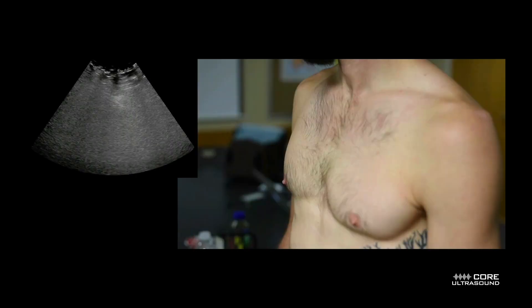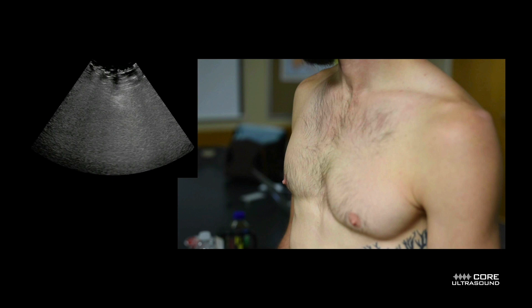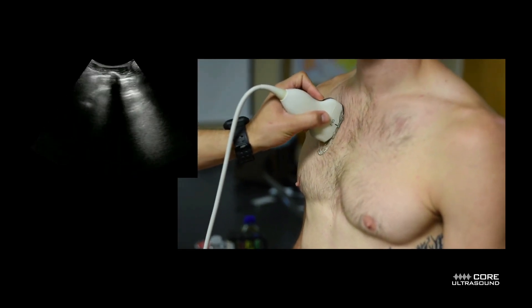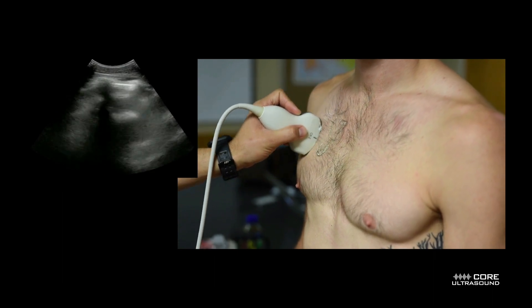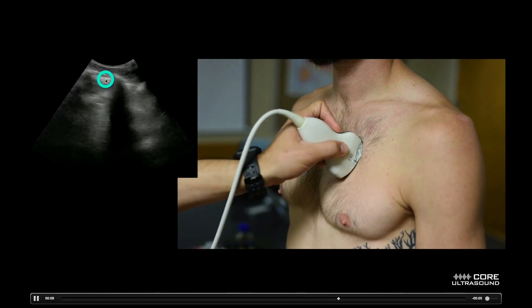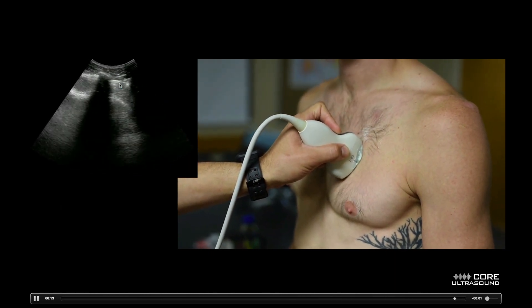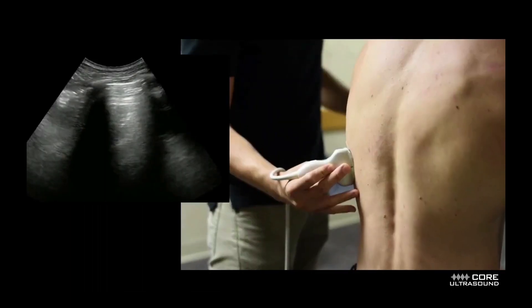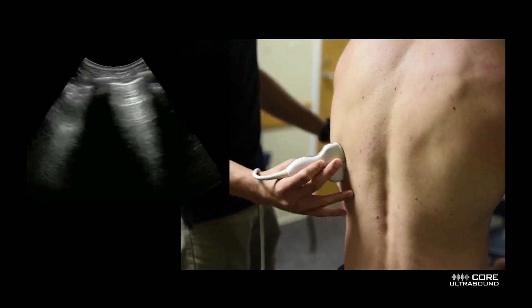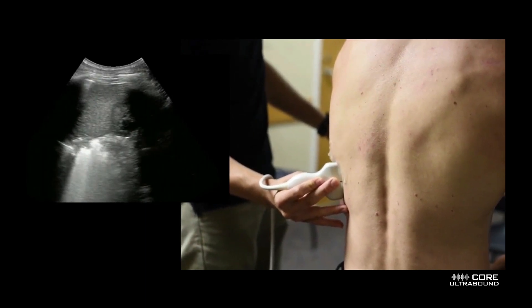When scanning the patient, I'll place the probe with the probe marker facing up and then lawnmower back and forth along the entire anterior, lateral, and posterior thoracic wall. The whole time I'm able to look at multiple rib spaces, looking at this white pleural line and asking: is there anything different about that white line?